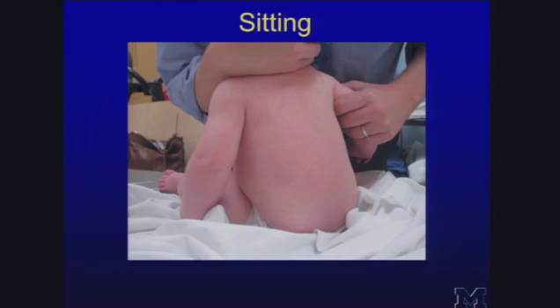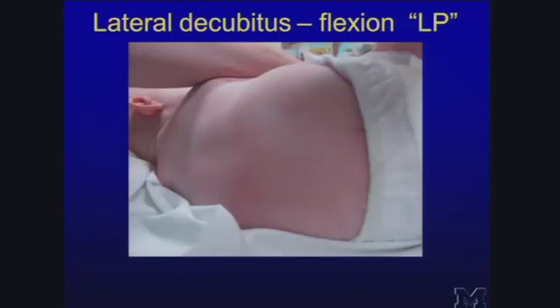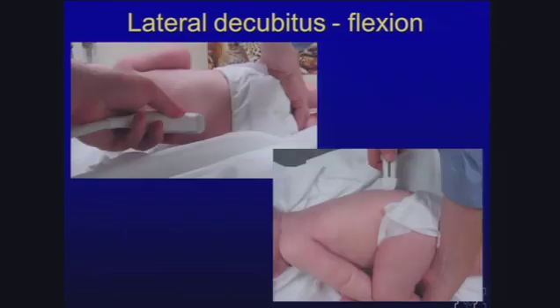The sitting position can work, and actually the child has to be supported because the child might fall over, and you want them to fall a little bit forward with flexion. And the lateral decubitus posture can work, so the child's on his or her side, but again you want to make sure that you flex the back somewhat to open up the spinal elements. As with any time with flexion, and this is a warning to pediatricians in performing lumbar punctures, you want to be sure that you don't have a small infant and you're so vigorous with your flexion that you actually make it hard for the child to breathe. You certainly don't want that to happen, and that amount of flexion is not necessary.